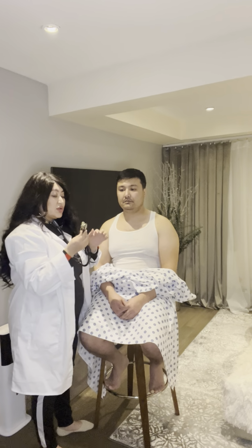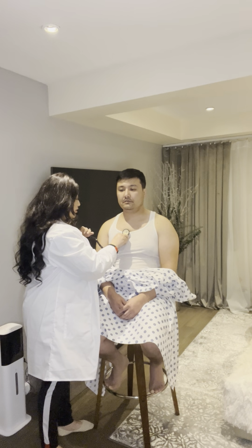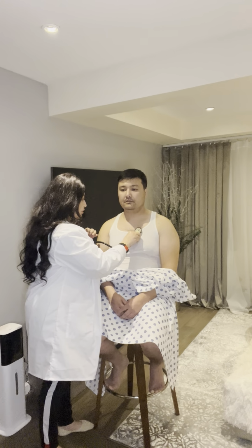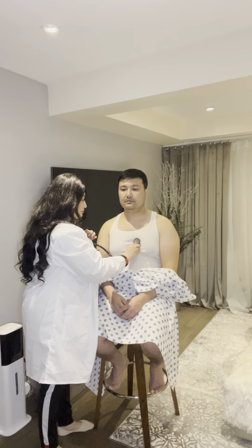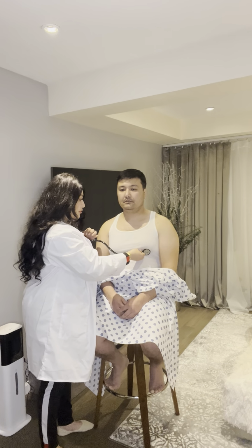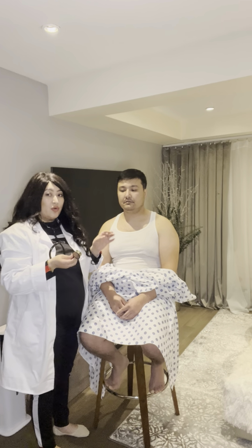Now I'm going to do the same with the bell of the stethoscope. Aortic, pulmonic, tricuspid, and mitral. Now I'm going to listen for the aortic murmur.